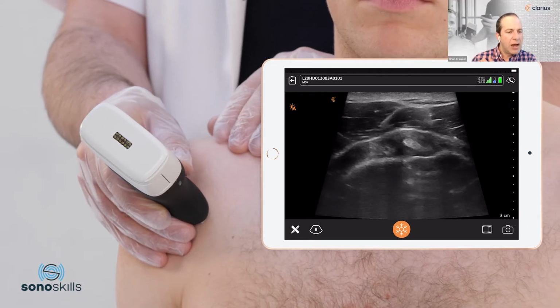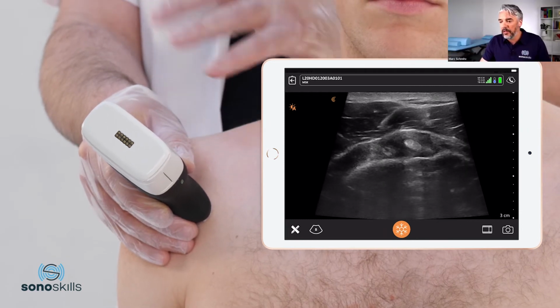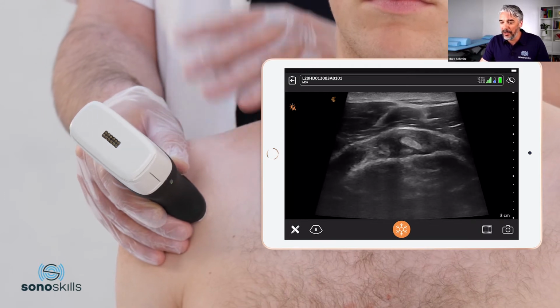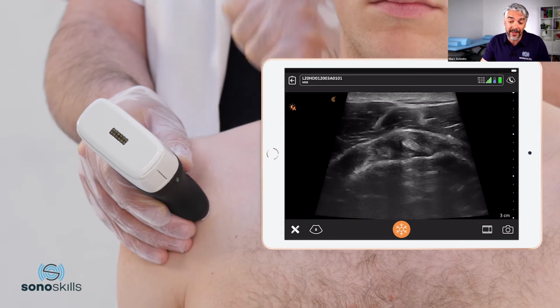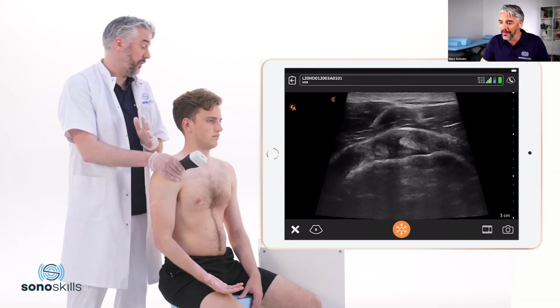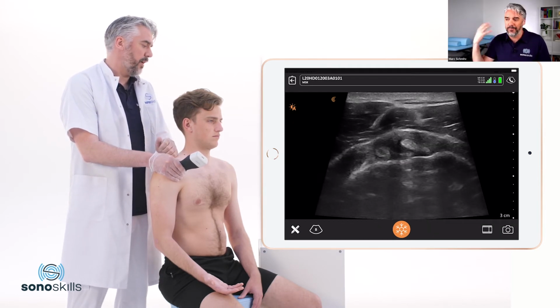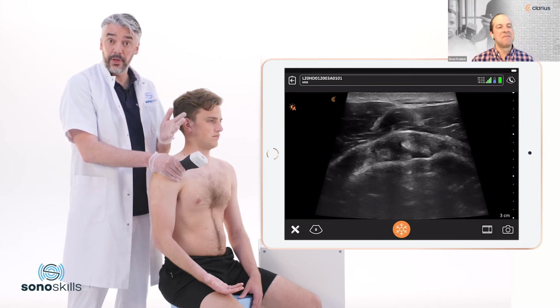Marc, do you always stand behind the patient when you're scanning the shoulder like that? Well, that's the Anglo-Saxon way of scanning. There is the Mediterranean way. At least in Europe, in Spain and in Italy, you can see a lot of scanning from a ventral approach. And in England, Sweden, and the Netherlands, we have this posterior approach. Both are okay as long as the output is normal.